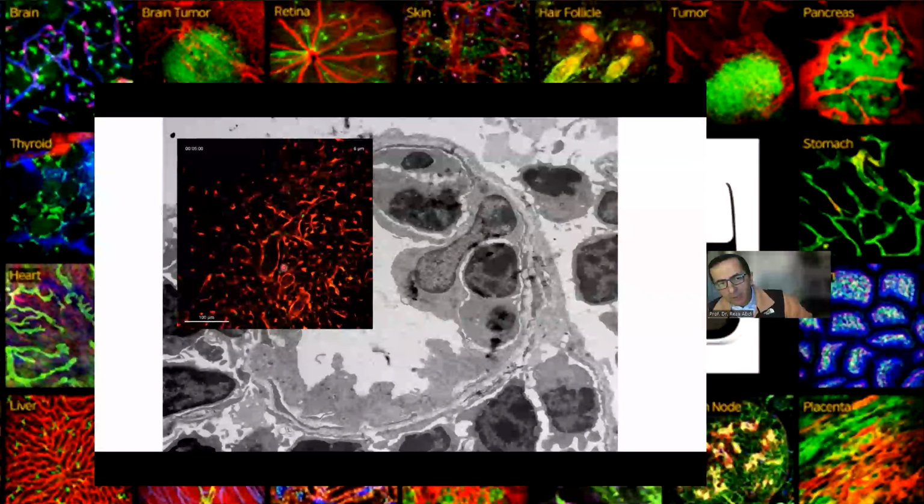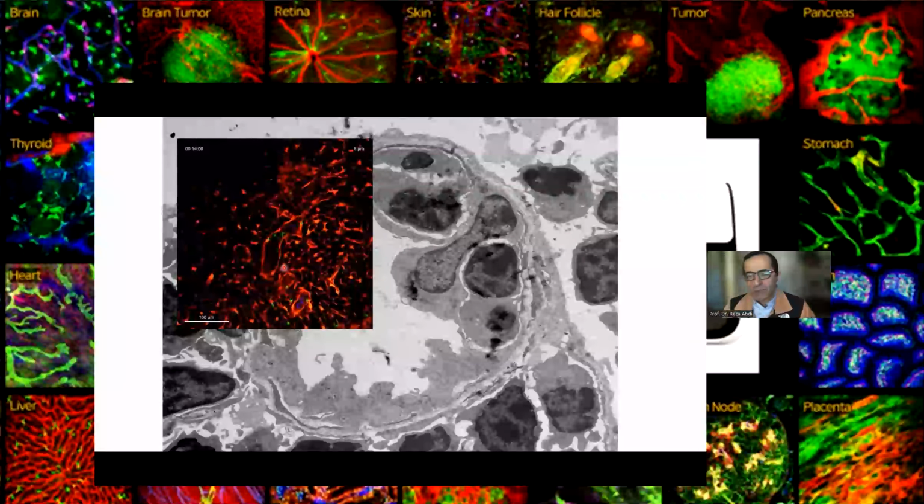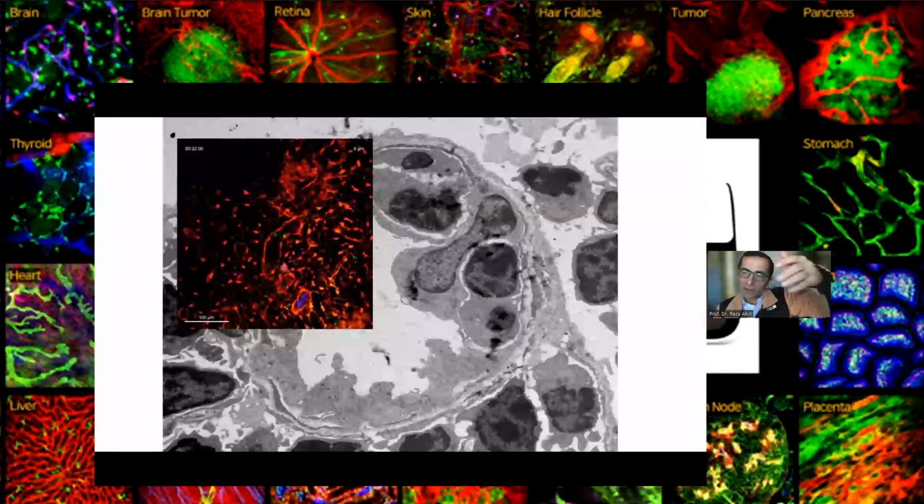So we are adding T cells to it, and we are adding other variables like dendritic cells. So we've been able to image some CD11c GFP. So you can actually add more to it, right? Because one of the things that we discovered, which was very interesting, is you can introduce different antibodies.